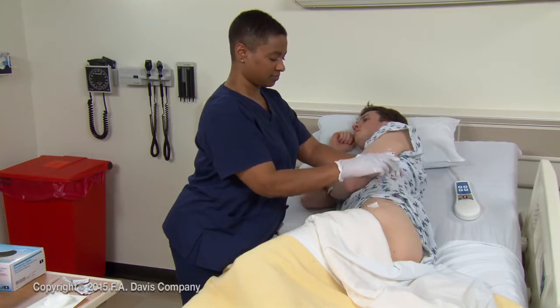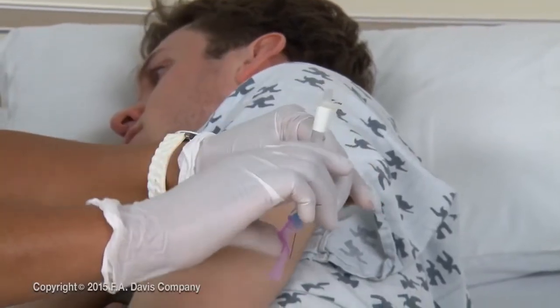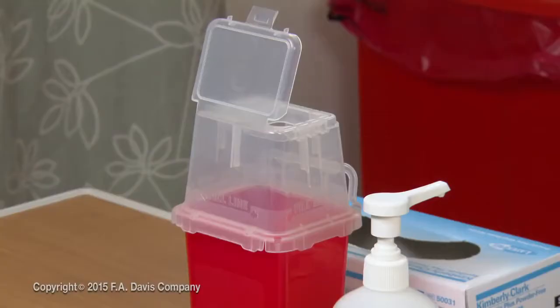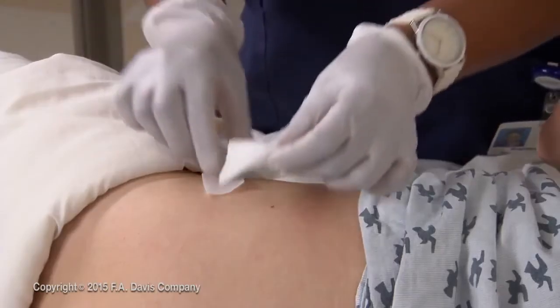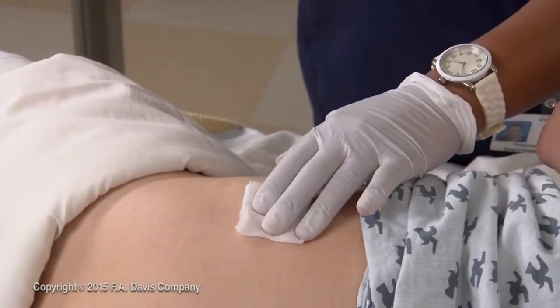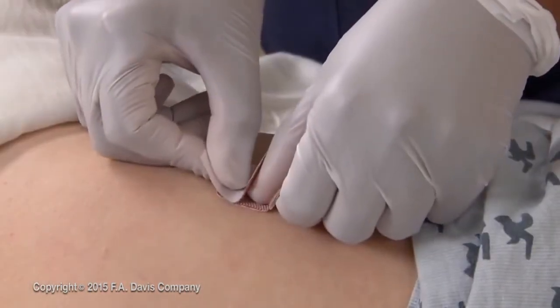Remove the needle smoothly along the line of insertion. Engage the safety needle device and dispose of the entire syringe in a biohazard container. Gently blot the site with a gauze pad and apply an adhesive bandage as needed.